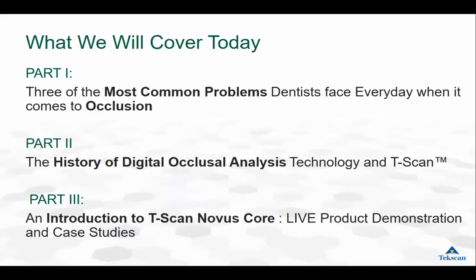All right, so in today's webinar, we're going to cover three different parts. First, we are going to cover the three most common problems dentists face every day when it comes to occlusion. Next, we are going to cover a brief history of digital occlusal analysis, technology, and T-Scan. And last but not least, an introduction to T-Scan Novus Core, including a live product demonstration followed by some case studies. At this point, we would like to ask a quick question via the poll about how familiar you are with T-Scan. So are you a current user, someone you know uses T-Scan, or you have limited knowledge of T-Scan?